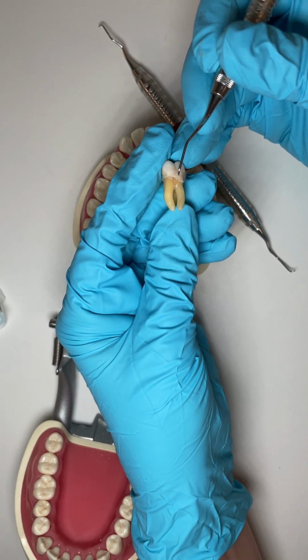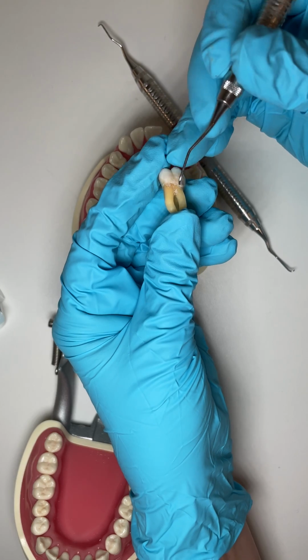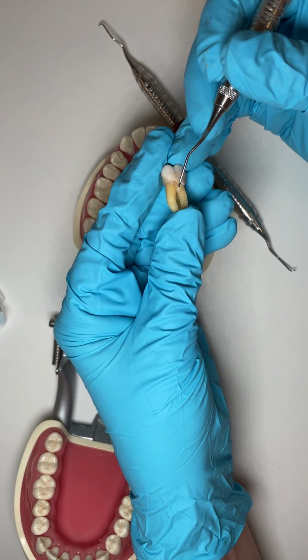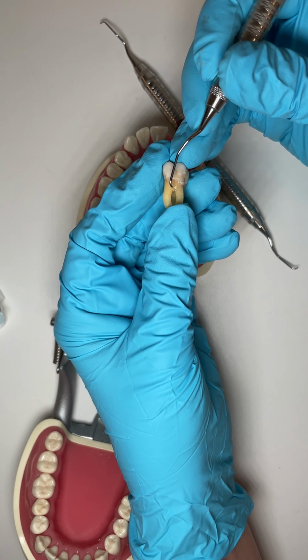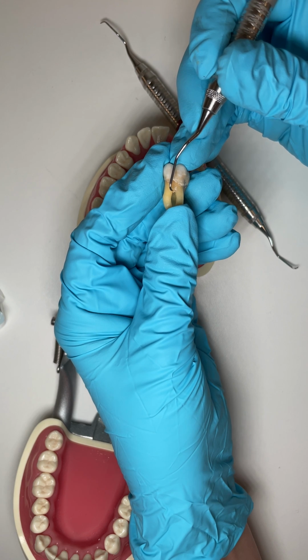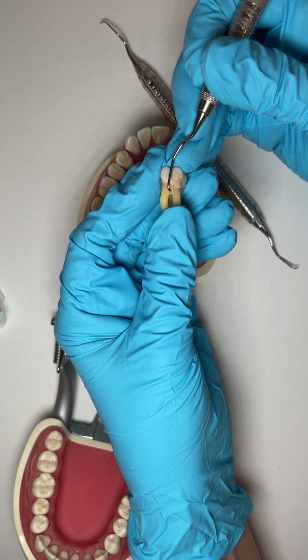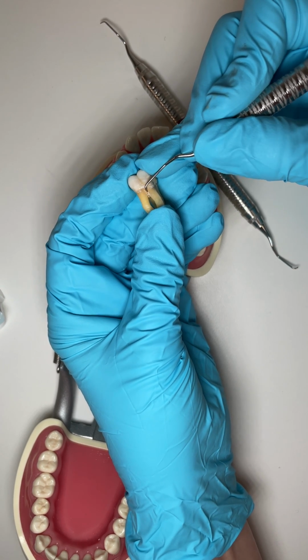Right, let's talk about how to clean a furcation of our maxillary first molar. Now this furcation is accessed from the buccal surface, and this is the distal root. So to clean the mesial portion of the distal root, I would use an 11-12 to clean the mesial portion, and I might even go down and give some horizontal strokes and get down in there.